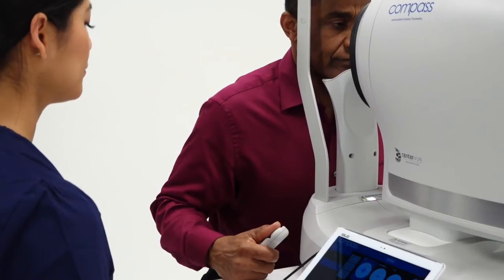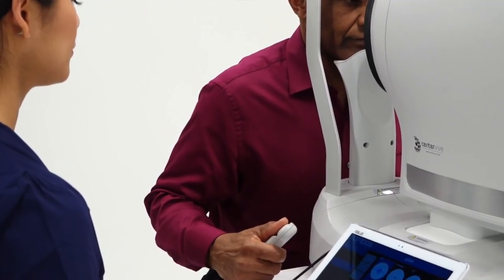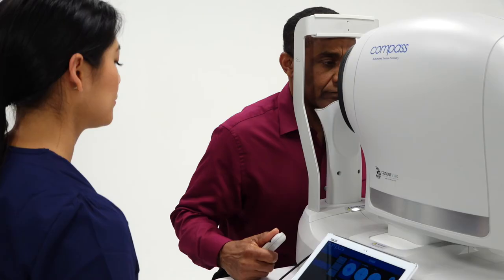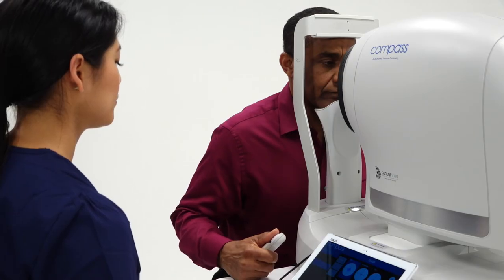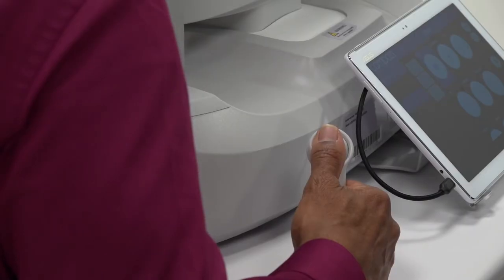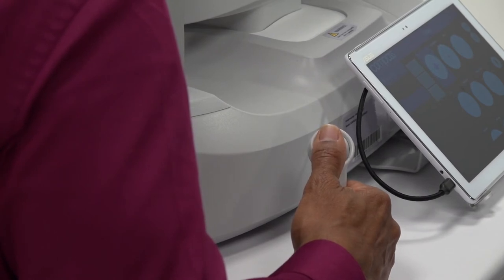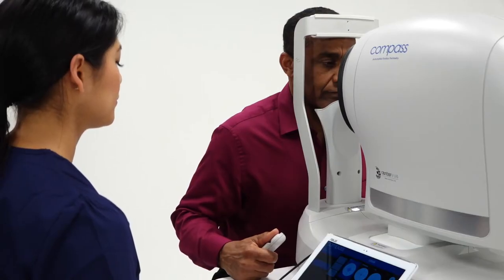Once properly positioned, instruct the patient on how to properly respond to the selected test. For a visual field, it is important for the patient to fixate on the green internal target and to press the patient response button when seeing a small white flash, or if they think they saw a white flash.